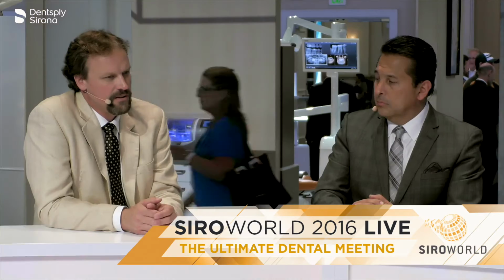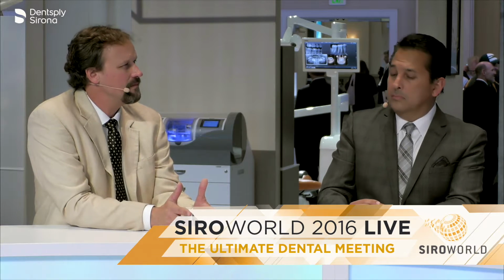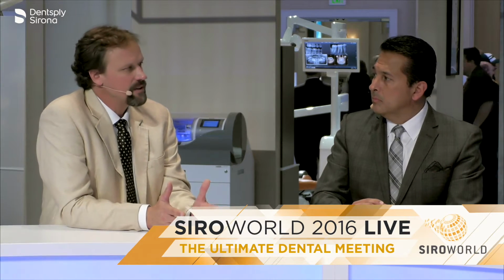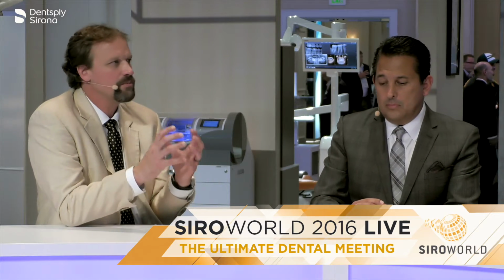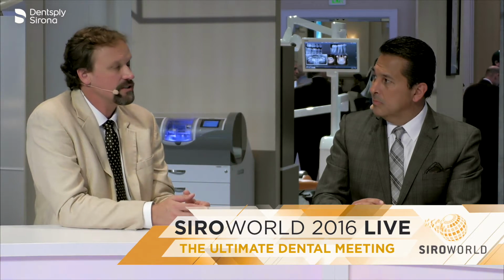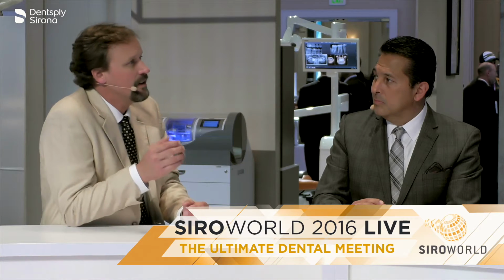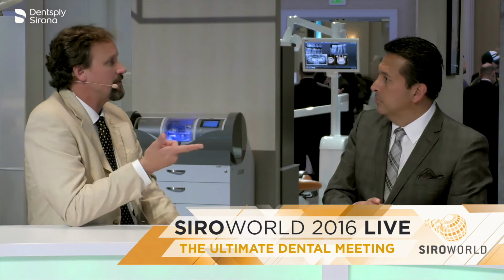But what they've been able to do with one particular material, and we were talking about materials in the last panel, is this. There are certain materials that satisfy many different requirements, but then they spread out to where they're maybe not the best. What they've done with Enamic is they've taken ceramic and resin and fused them in a completely different way. This is a completely new way of thinking about dental materials, and I think it could potentially be where dentistry goes. So imagine this, Daniel. Imagine we don't have to fire anything ever.